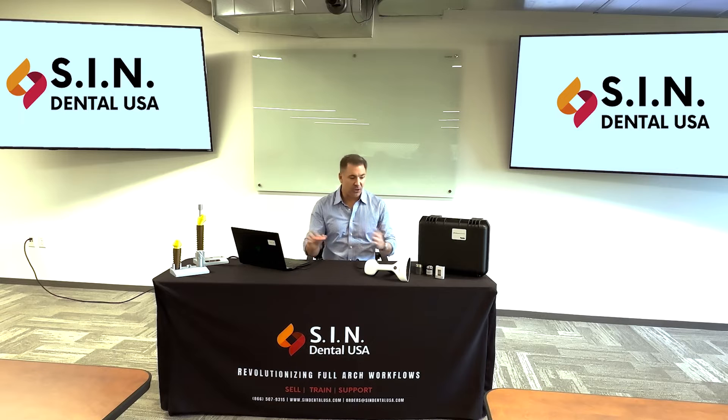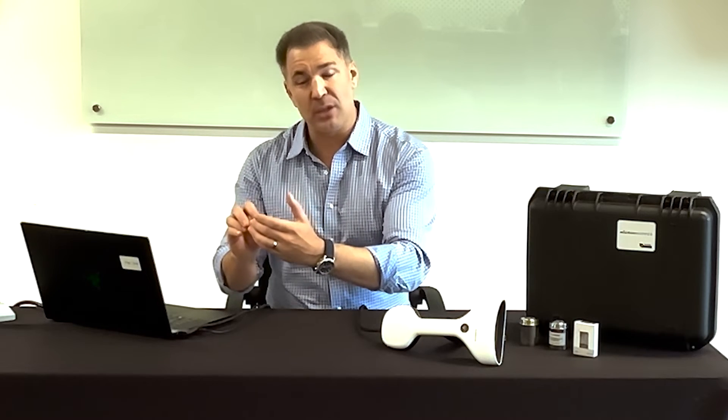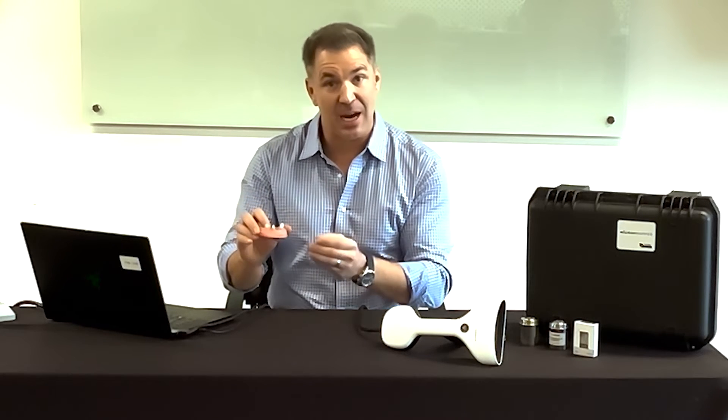Some people like to have all 30 scan bodies — that's 3 sets, because they come in sets of 10. Each one has a number on the front, and you can replace each scan body individually. The first set is numbered 00 through 09, the next set 10 through 19, and the third set 20 through 29.